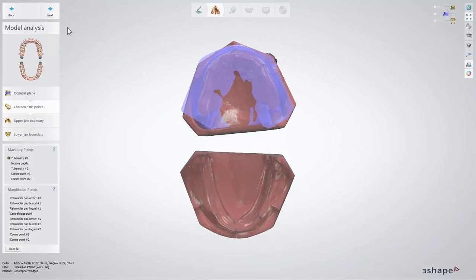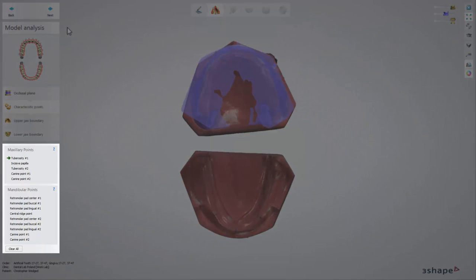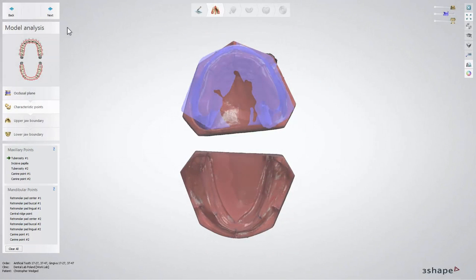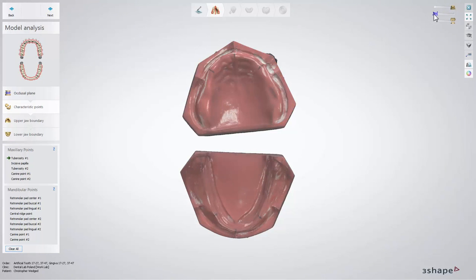For those of you who have worked with our previous version, it will be easy to see that the characteristic points for mandibular have changed. Now there are a few more points to define. Start with maxillary points: select the tuberosity, next the incisive papilla, second tuberosity, and two canine points.